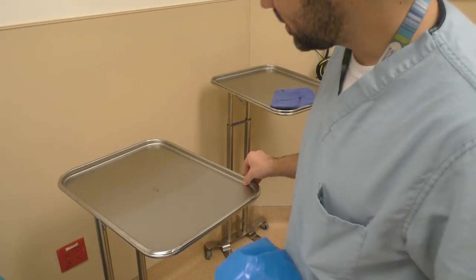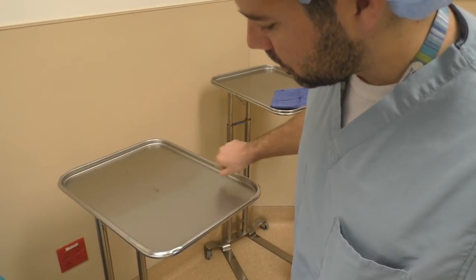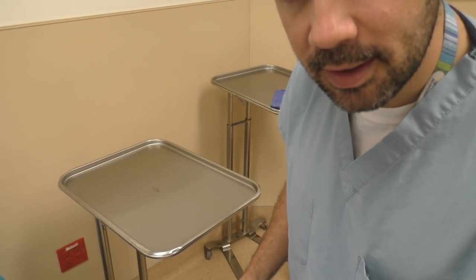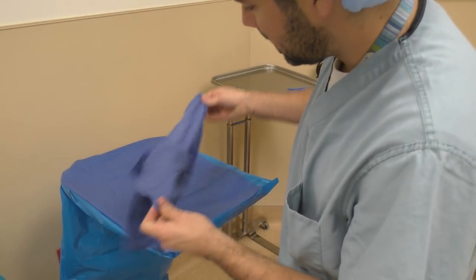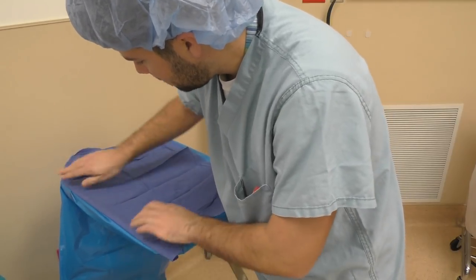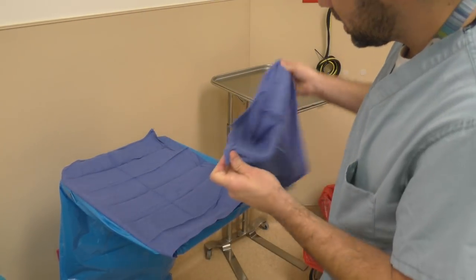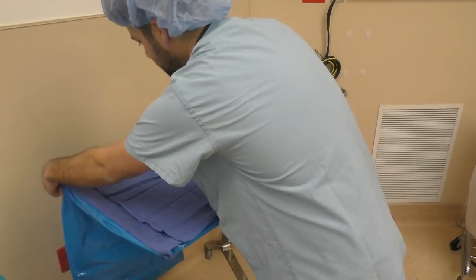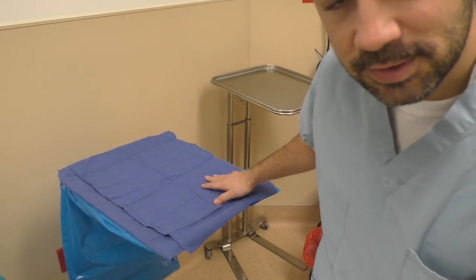Now the mayo stand — it's got a detachable tray, and we're going to utilize that tray by lifting it up and tucking our towels inside of it after we drape it. We're going to utilize our towels going the length of the mayo stand and tucking it underneath that tray to secure it on one side, then take a second towel to cover the rest of the mayo and tuck it in on the far end. Now you have a nice reinforced mayo stand.